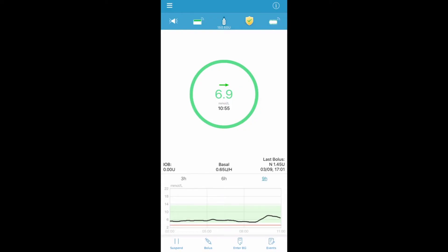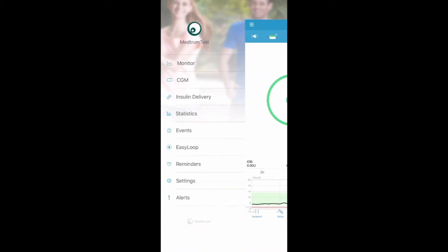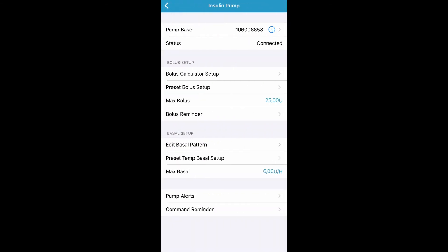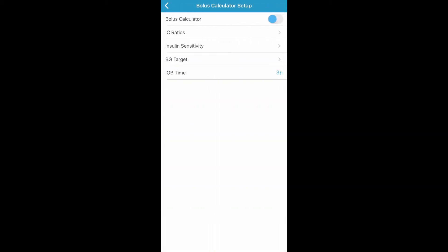To set up the bolus calculator on your EasyPatch app, tap on the three lines in the top left hand corner to access the main menu. Tap on Settings, then tap on Insulin Pump, then tap on Bolus Calculator Setup. Ensure the bolus calculator is turned on.